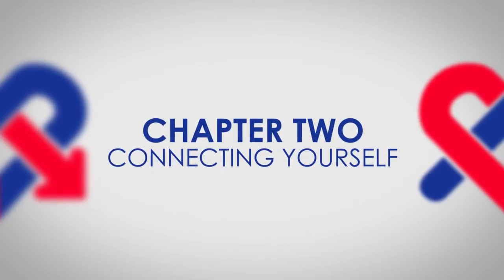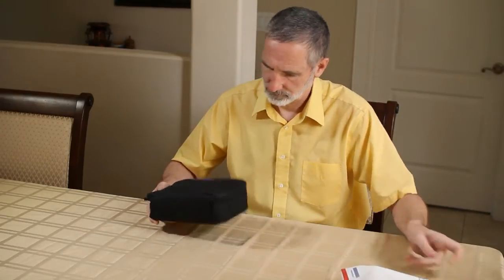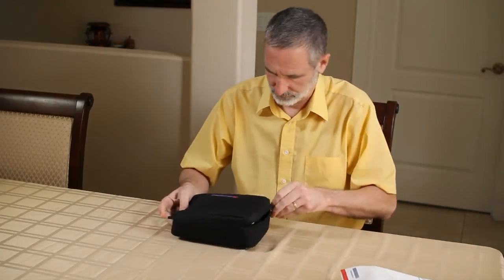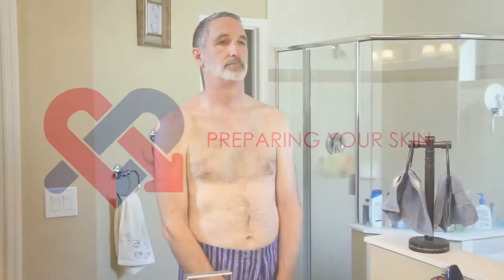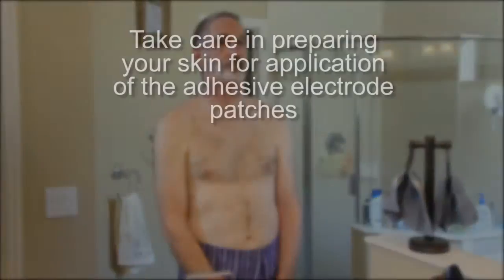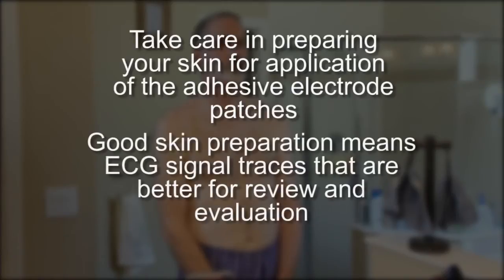Connecting yourself. The doctor's office may have connected you to the monitor, or you may have received the monitor in the mail to hook up yourself. Let's take a moment to review the process on how to connect yourself. Preparing your skin: before applying the electrode patches, take care in preparing your skin for application of the adhesive electrode patches. Good skin preparation means ECG signal traces that are better for review and evaluation.